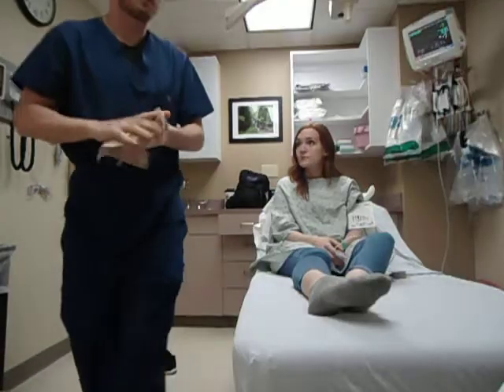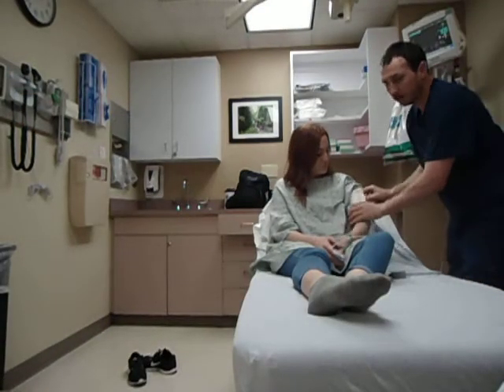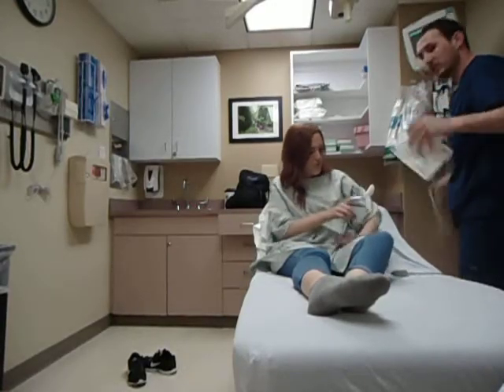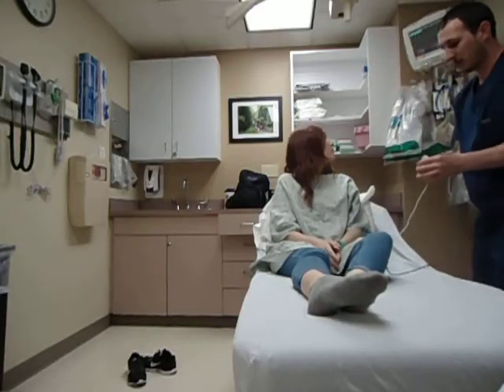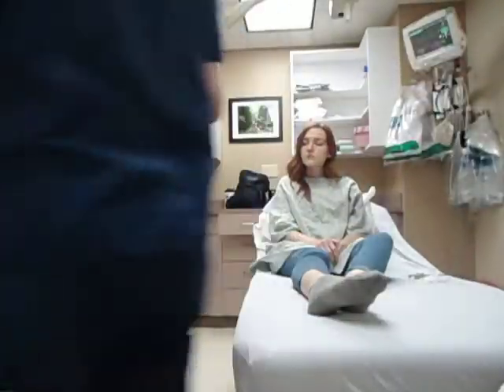Her blood pressure is 101/61, and I could do a manual blood pressure obviously, but for the sake of time we're going to go ahead and press on. Oxygen's 100%. I counted the respirations while I was doing her temperature, and she said about like 16 breaths per minute.